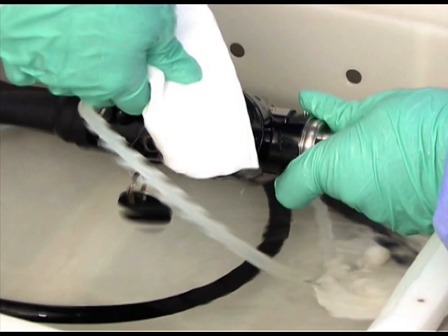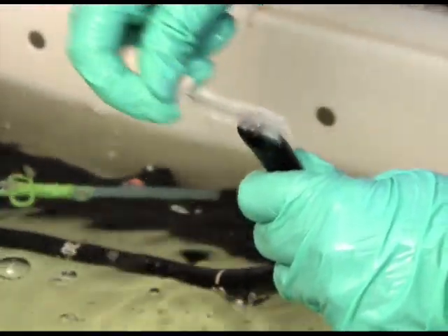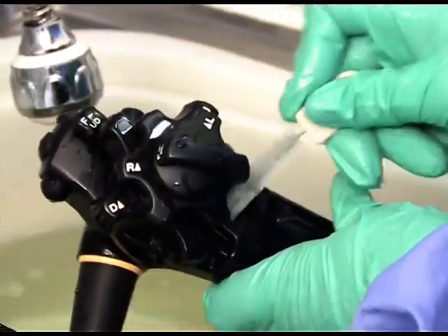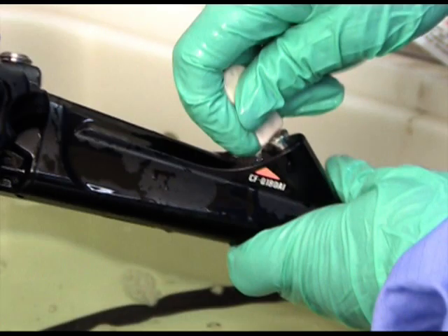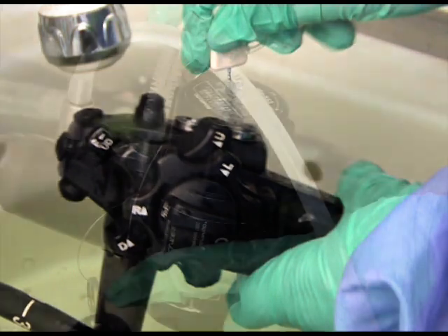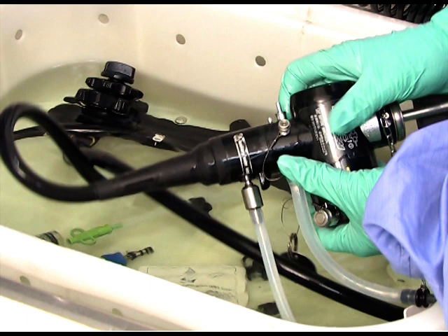Wash all debris from outer surfaces by brushing and wiping the endoscope. Use non-abrasive and lint-free cleaning tools to prevent damage to the instrument. Use a soft brush to gently clean the distal tip. Brush the control handles — soft toothbrushes are useful to clean grooved handles. Brush the biopsy port, brush around valve seats and clean thoroughly, and finally clean the suction port. Check that all visible debris has been removed.